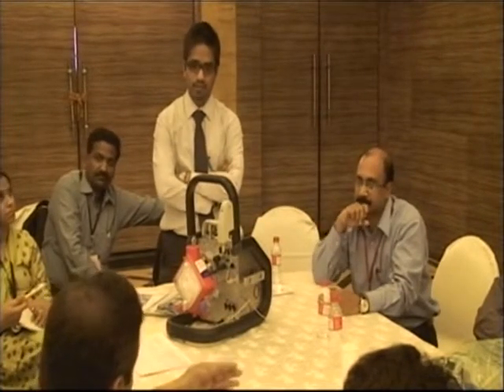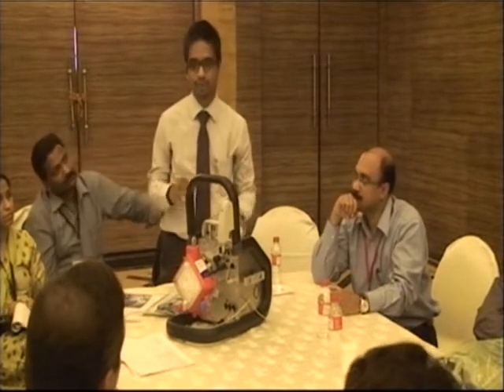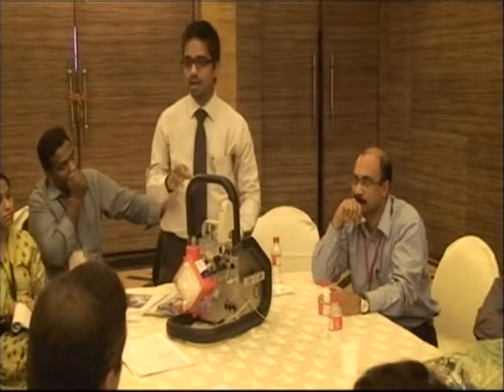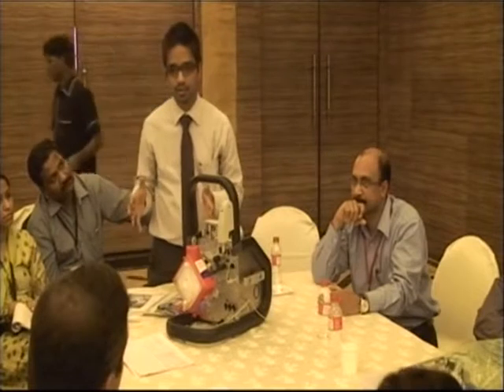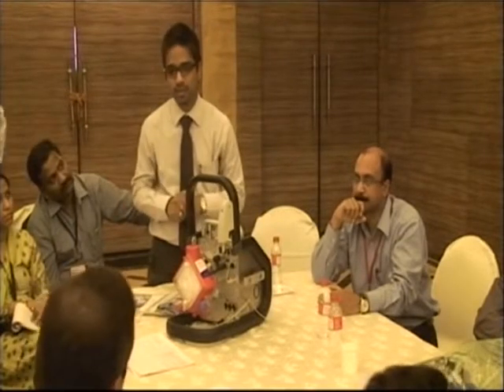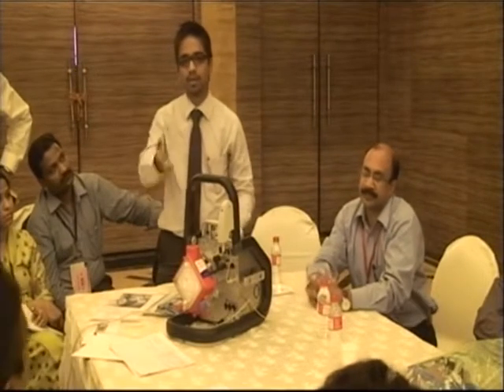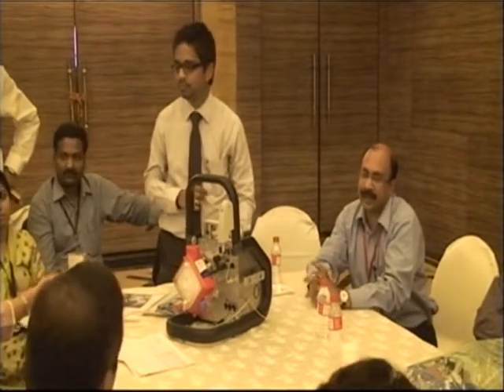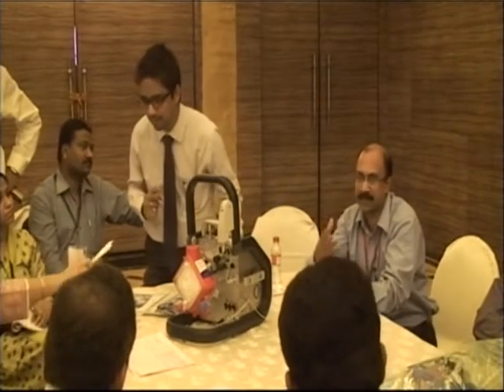Because your machine is going to take care of it. It's not out of function, it's partially functioning. For example, if you take the heart, the volume load into the heart may be a CVP of 10, so we keep a CVP of 4. So it's like a partially working heart and partially working lung with lung protective ventilation. Instead of putting the actual load, you just allow the heart to relax.